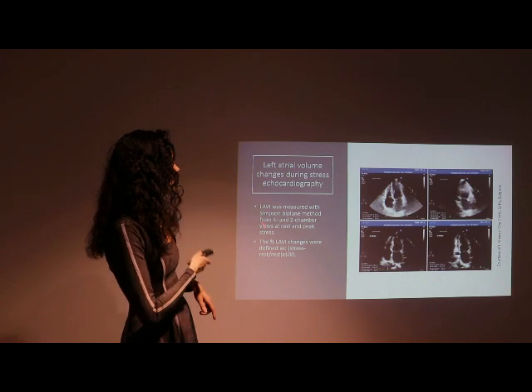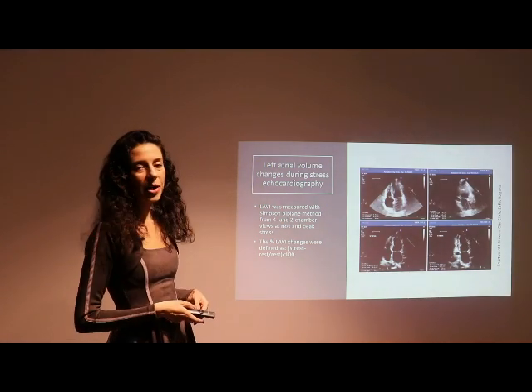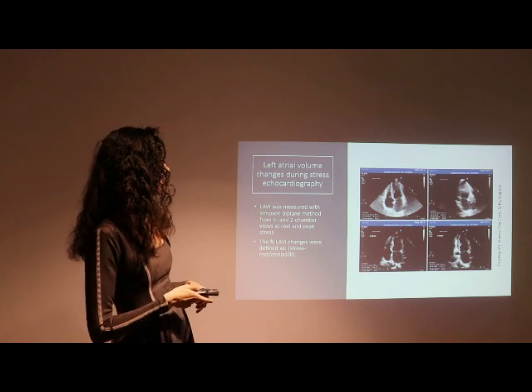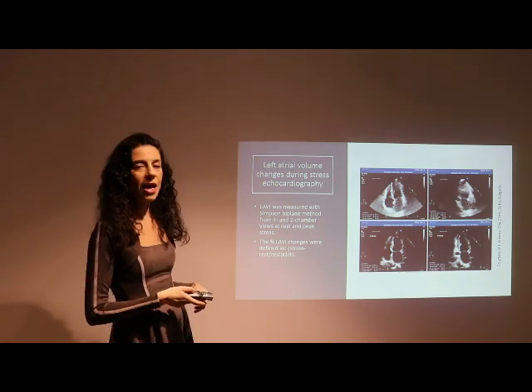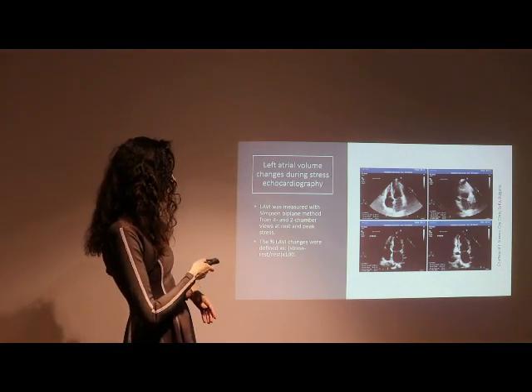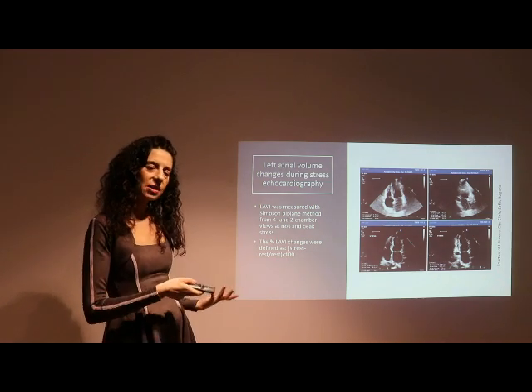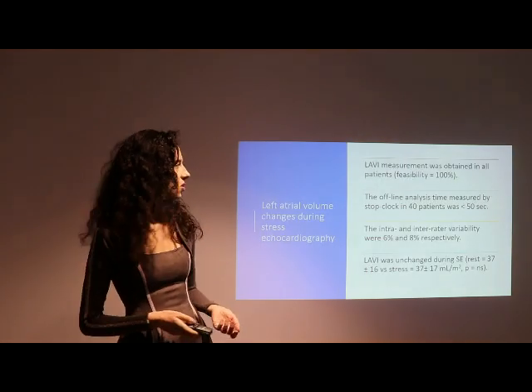So left atrial volume index, or LAVI, was measured with the Simpson biplane method from 4 and 2 chamber views at rest and at peak stress, and the percent LAVI change was defined as the stress minus rest divided by rest values and then multiplied by 100.